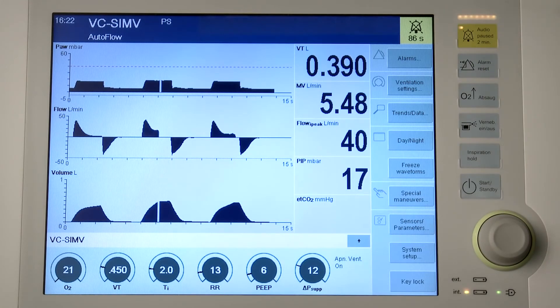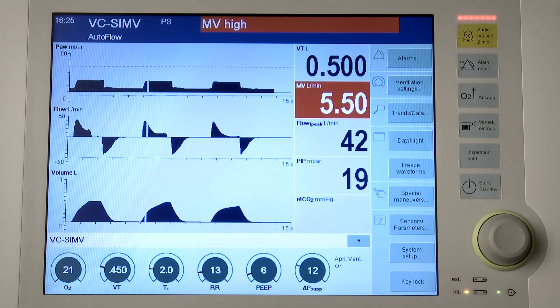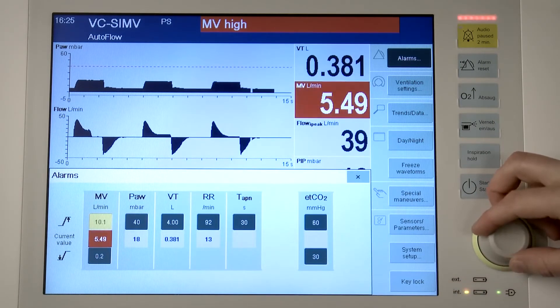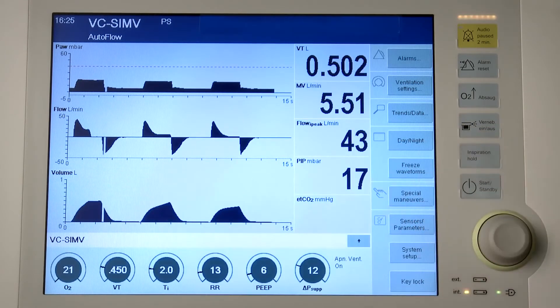There are two options to open the alarms dialog window. To set the alarm limit, touch the alarms button in the main menu bar or touch directly into the alarms dialog window. Touch the corresponding button for the alarm limit. Set the value by turning the rotary knob and press to confirm.